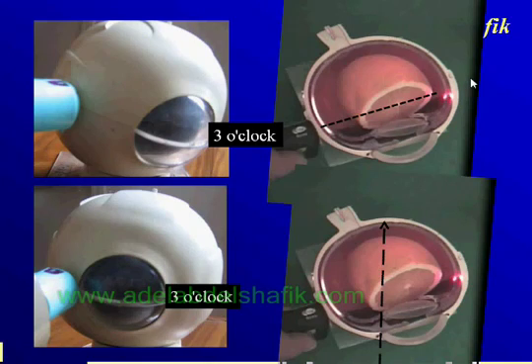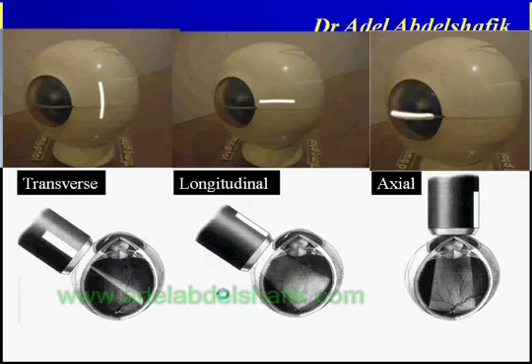It's a transverse section. A real transverse is that we should move our transducer here, here, and here. This is a real transverse all the time, but this is inaccessible. We're always at the limbus. Or even we can go a little bit to the equator, but we cannot go behind that. So even if we get a little bit, not a real transverse, we describe it as transverse.